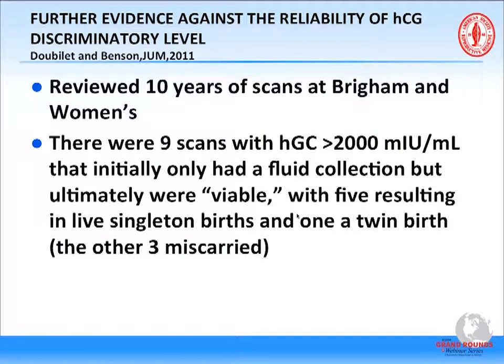Carol Benson and Peter Doubilet, a husband and wife team at Brigham and Women's, good friends of mine, radiologists, published in the Journal of Ultrasound in Medicine a 10-year review of scans at Brigham and Women's. They said they had 9 scans where the hCG was greater than 2,000, that initially only had a fluid collection on ultrasound, but were ultimately deemed to be viable. 5 resulted in a live singleton birth, 1 a twin birth, and the other 3 miscarried.